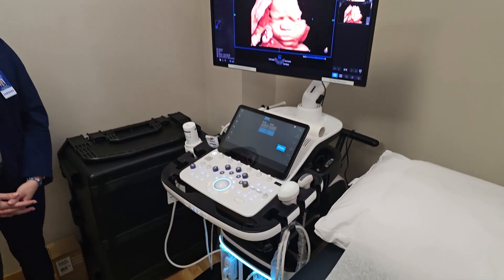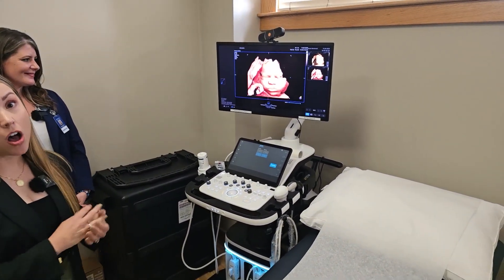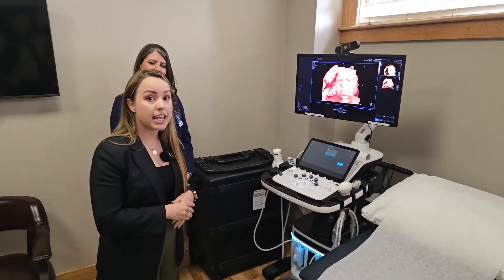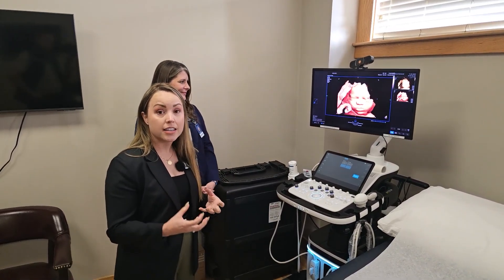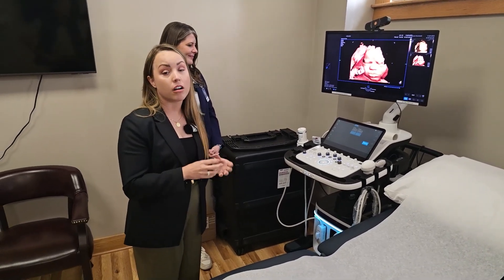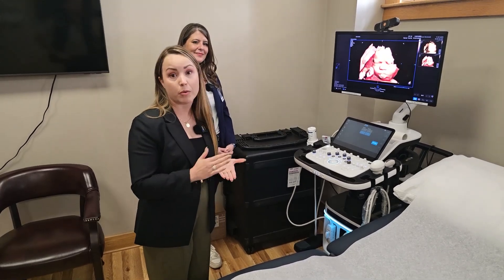A huge part of the OB survey is reviewing all anatomical structures within the baby. We do a very detailed review of the fetal heart using color and Doppler. There are fetal echos — a specialty within OB-GYN — where they look at the heart in great detail to identify any type of defects that could be corrected right when the baby is born.